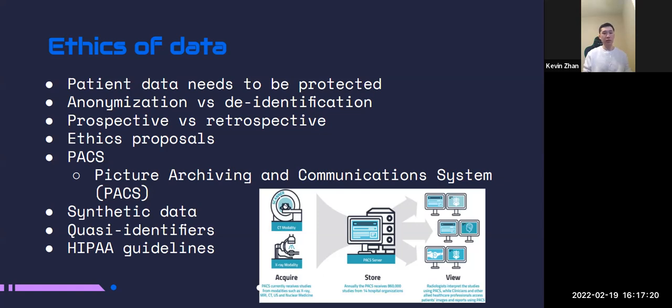The next thing I'd like to talk about is PACS. So this is picture archiving and communication systems. This is a tool used by physicians where the data that they get is stored in a non-physical secure server, right? So this centralizes a lot of the patient data, and only physicians are able to access it, not ML technicians. Because of this, clinicians or physicians have to work together with ML engineers to basically get access to it and work on it.